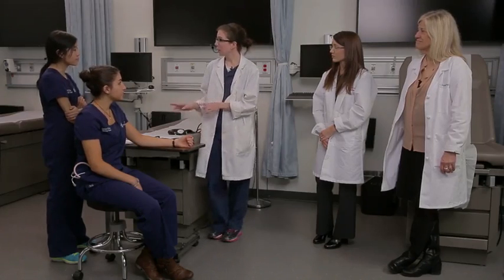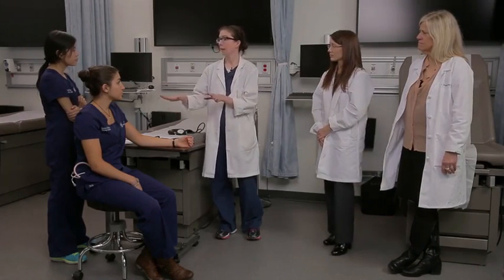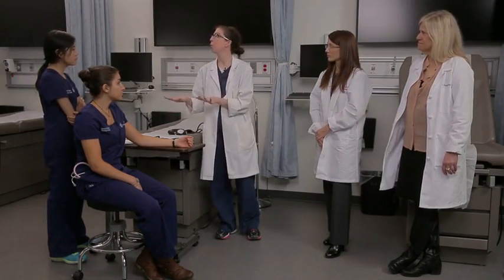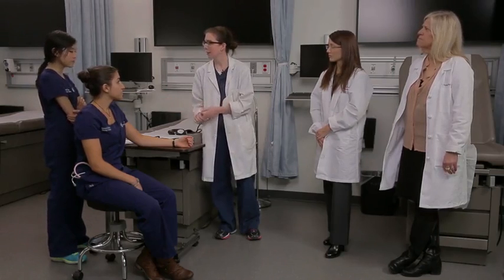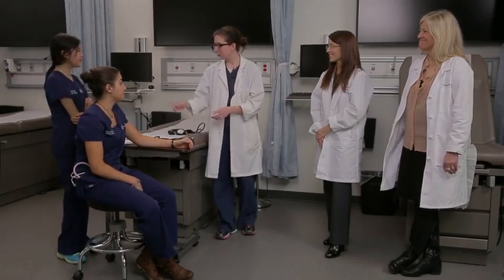We're really tough on our students, but you can see how important it is to understand the anatomy and physiology behind what we do in the clinic. Now, before we get started practicing, I want to remind you that when you take someone's blood pressure in the clinic, you want to give them a few minutes to rest and relax — in case they're very happy or nervous about seeing you, or if they had to rush to their appointment, you want to give them a chance to get back to their normal blood pressure. Do you have any more questions? Not at the moment. All right, let's get you set up and practicing on each other.